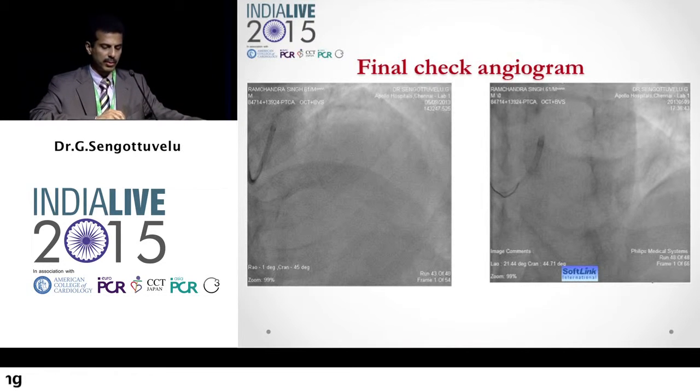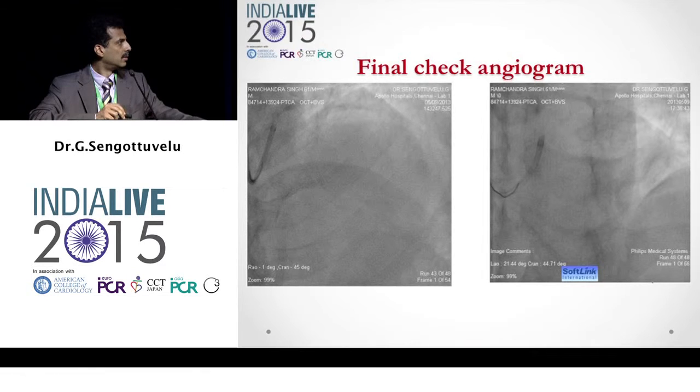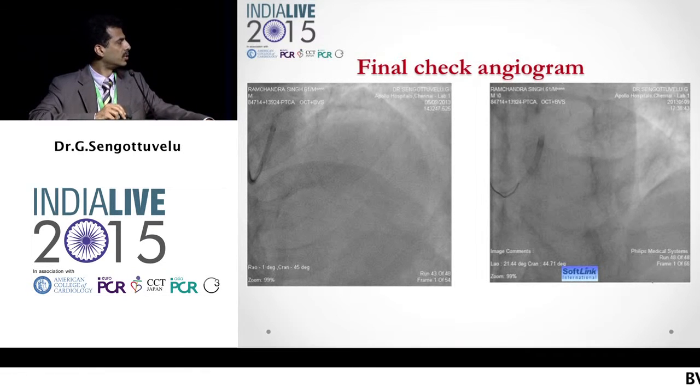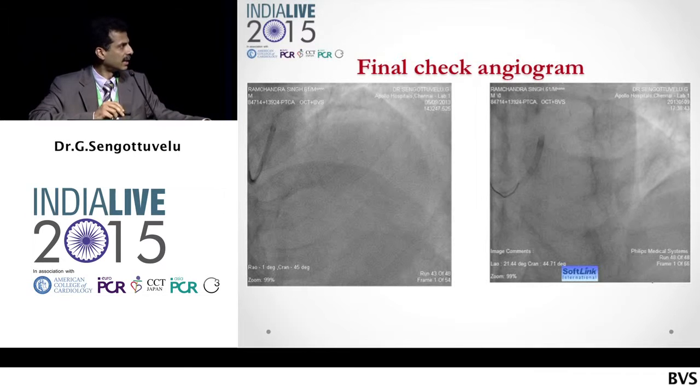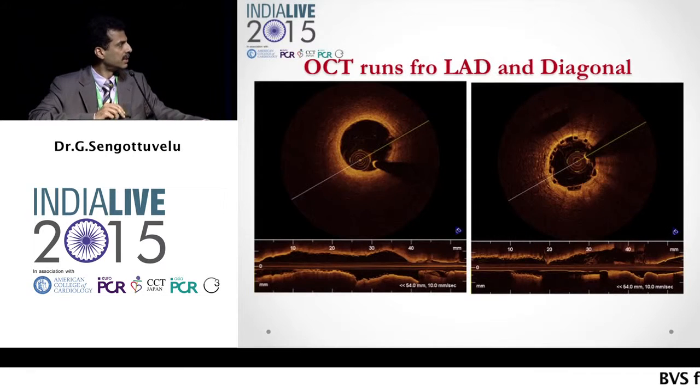We then did an OCT. This is the final check angiogram, which showed a very good result of both the LAD and diagonal. I will show you the OCT images — the still images.